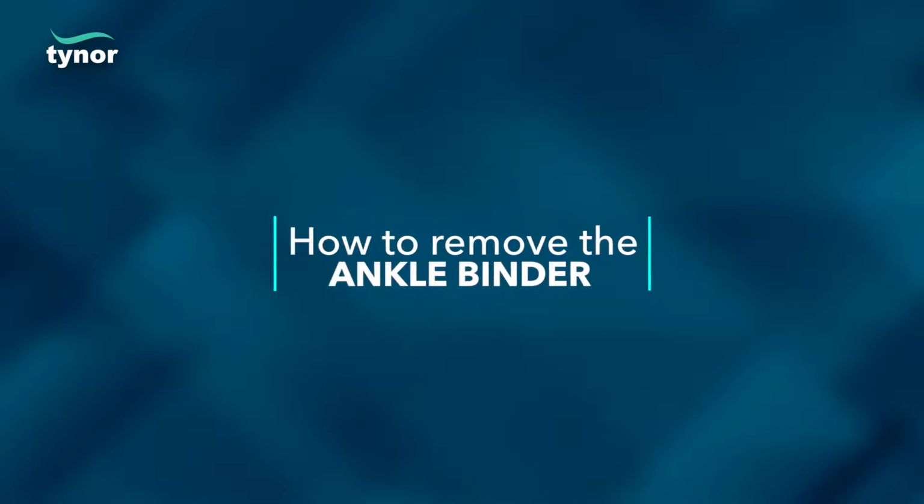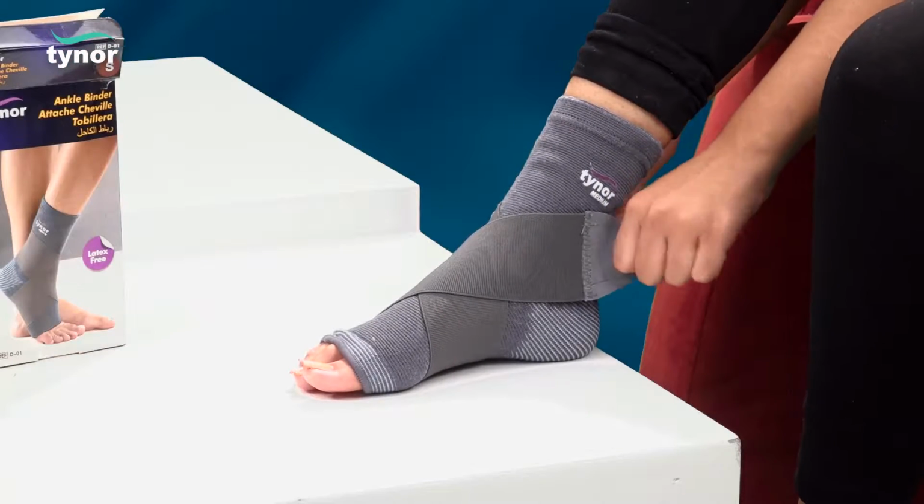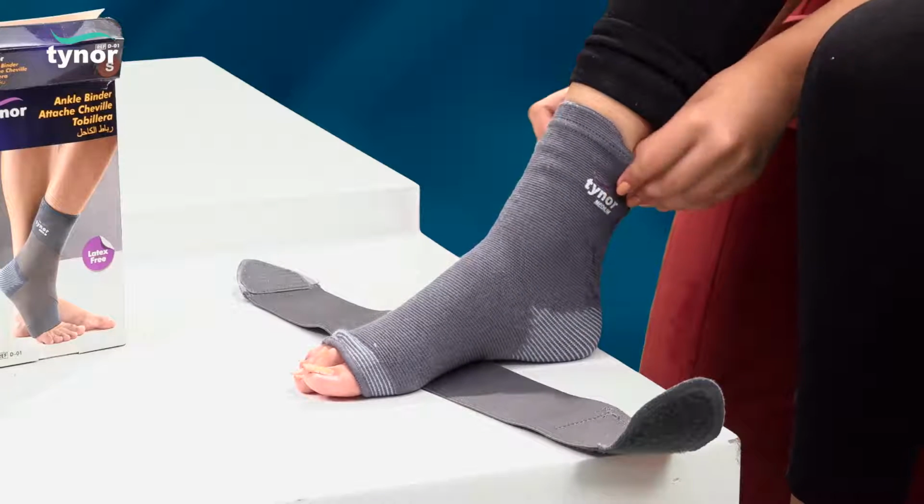Now, let us see how to remove the ankle binder. The product can be easily removed by unfastening the elastized strap and pulling down the compression sleeve.